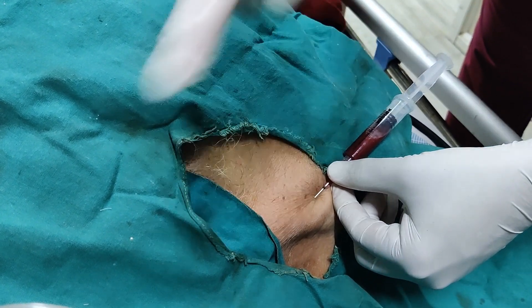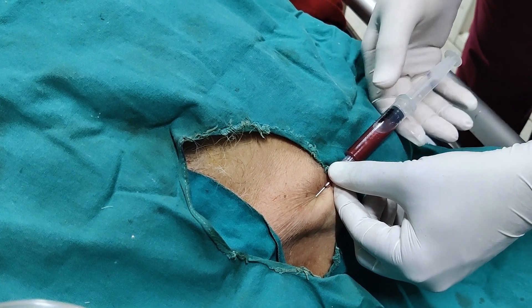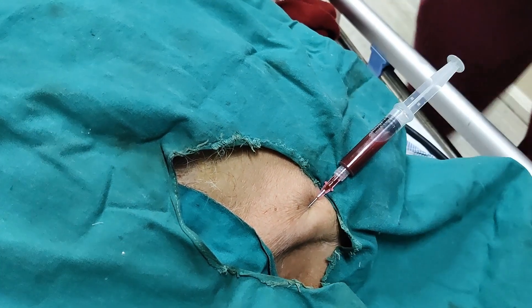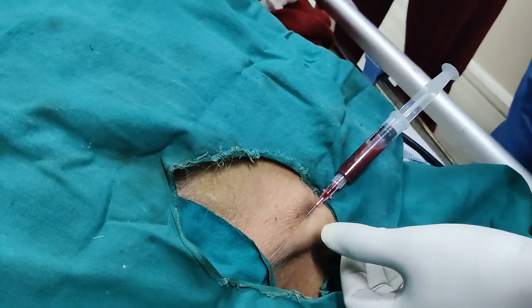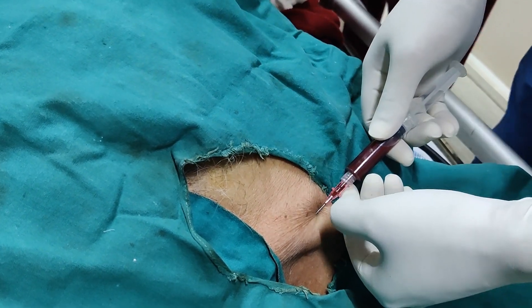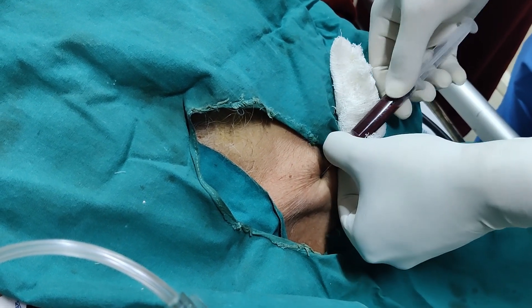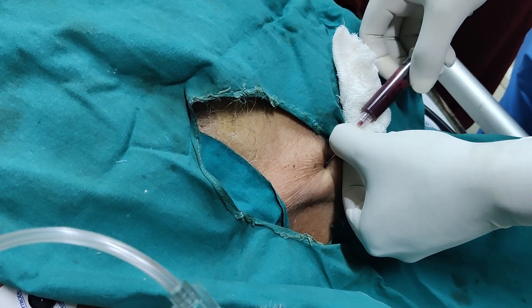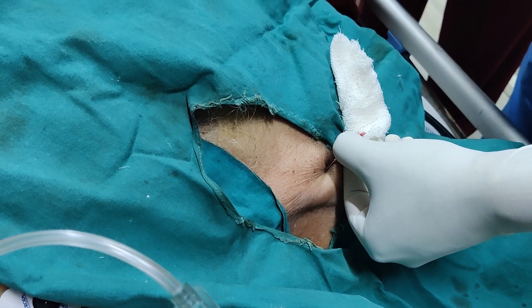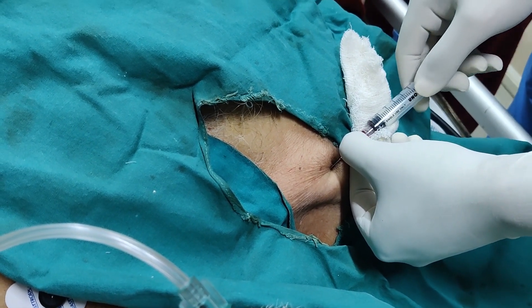Stop advancing when a flash of blood appears in the barrel of the syringe. Hold the syringe motionless in this spot — even a slight movement may displace the needle tip from the vein. Carefully rotate the introducer syringe so that the bevel of the needle now faces inferiorly.